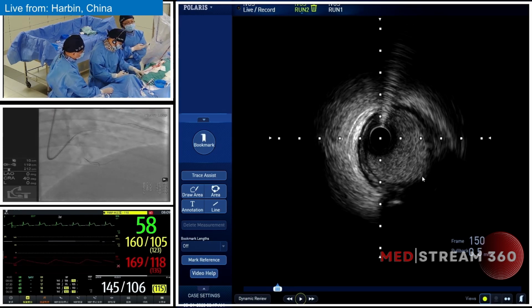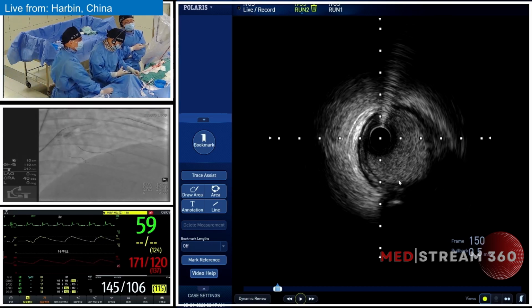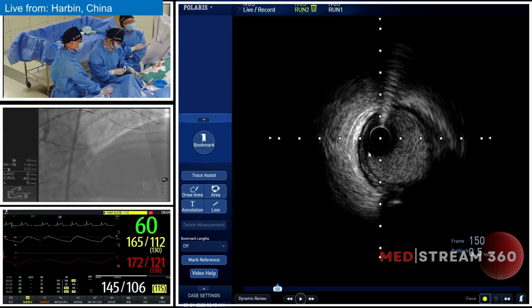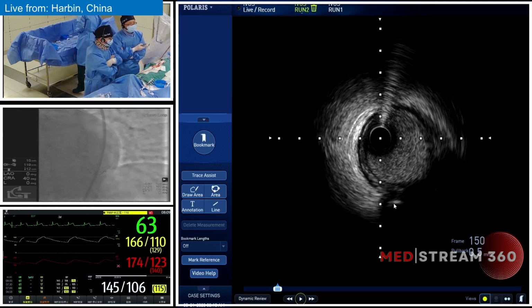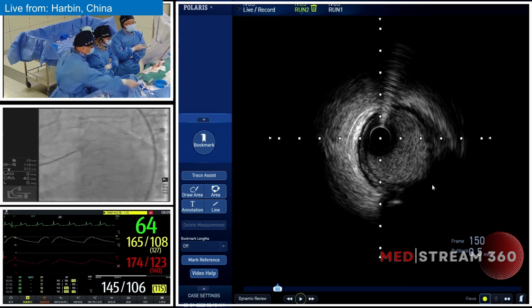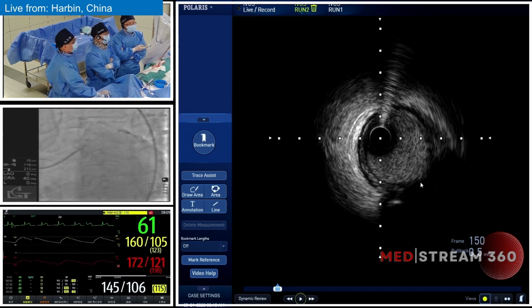First, it's a very big LAD vessel joining into the side branch. And also at the opening of the side branch from the CTO segment, it's very clear. There is almost no plaque. Second thing is that there is some mild calcification on the side of the occluded LAD, which may cause some problem to the antegrade puncture during the next antegrade procedure.